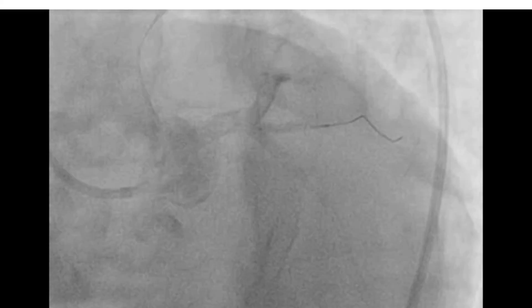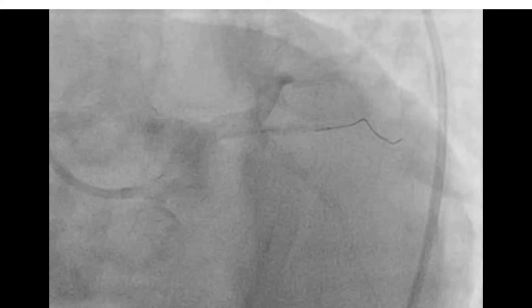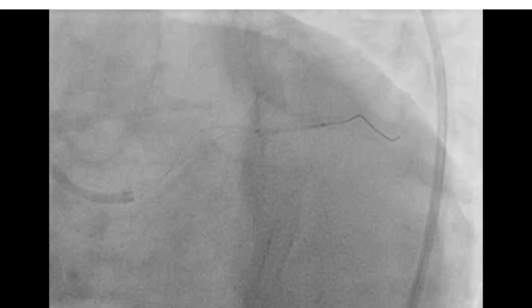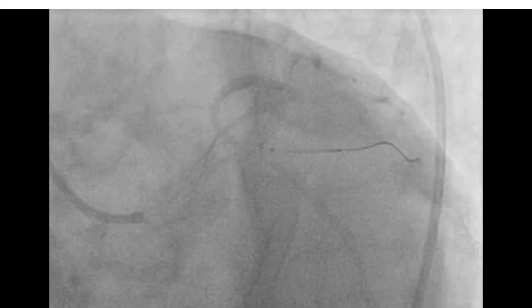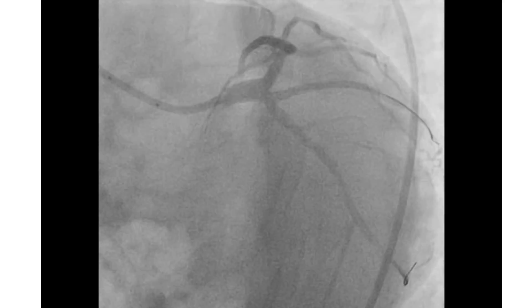We took out the stent and threaded the most proximal cell with another wire and reintroduced it. We can see it positioned and fixed well at the ostium of the OM. And this is the result after deployment.